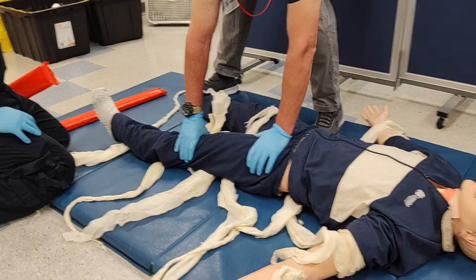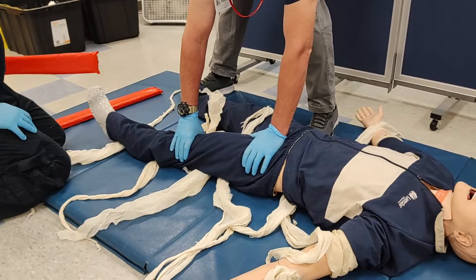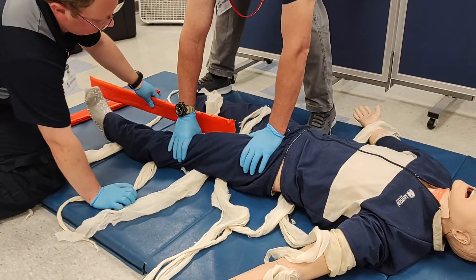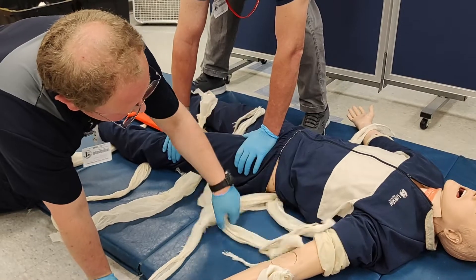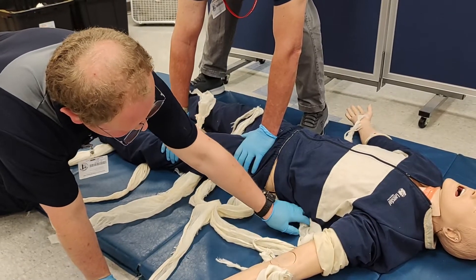One will be underneath the small of the back over the iliac crests, and finally, the uppermost will be on the lower regions of the ribcage.